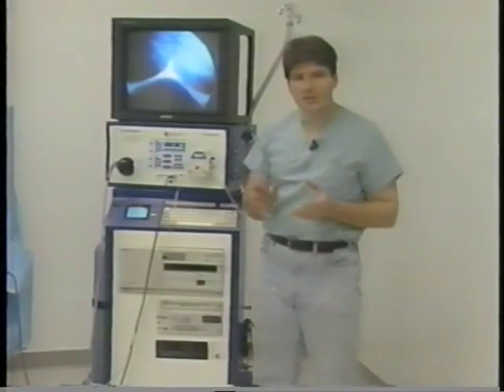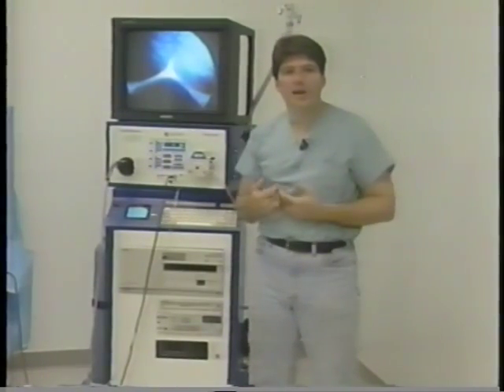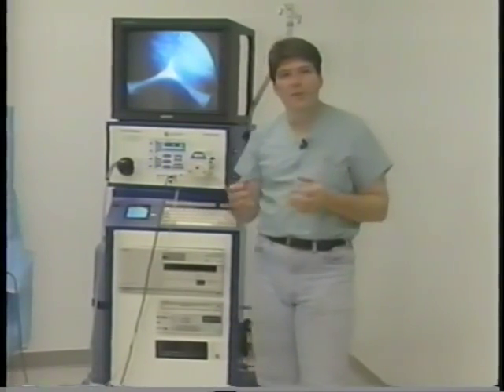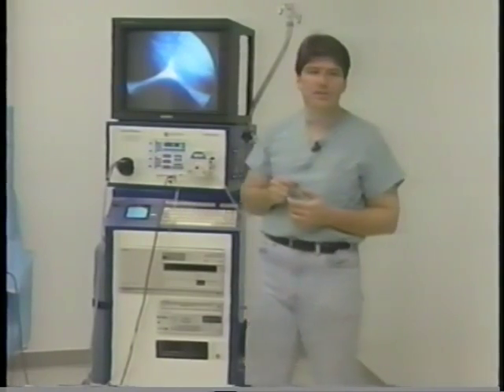Next, we offer two types of irrigation systems. A peristaltic irrigation system, which is used mainly in angioscopy, orthopedics, and urology — not commonly used in laparoscopic surgery. And then we also have a pressurized irrigation system, which is done through bottles that are located on the side of the machine.